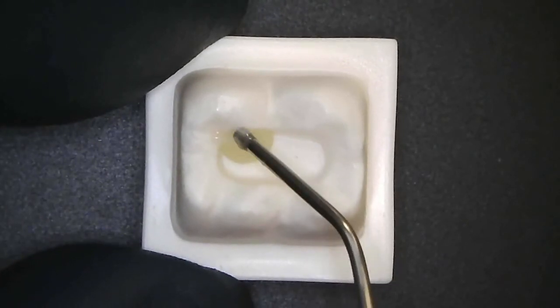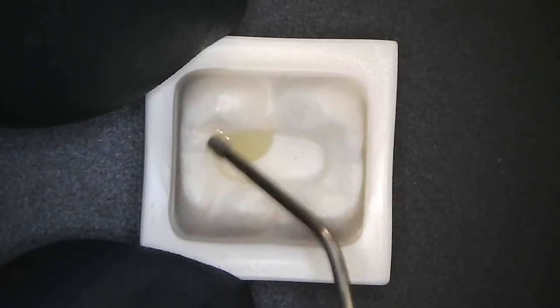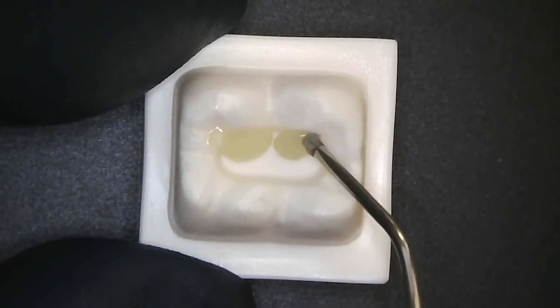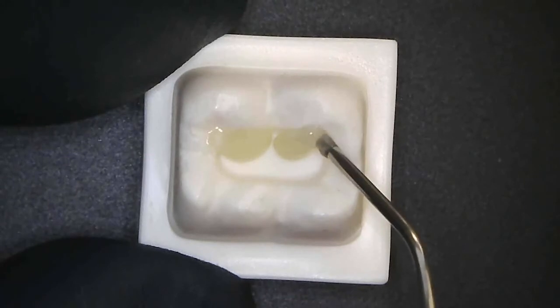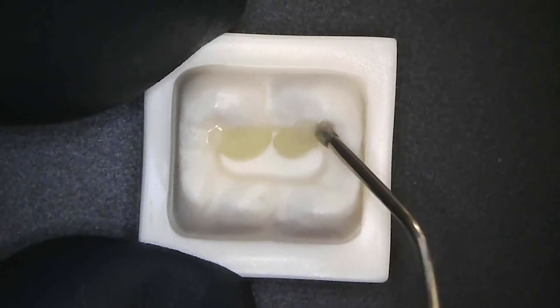Using the syringe tip, I can create a feather edge up the incline of the cusp. And here's the other cusp — you'll see it maintains its shape very nicely thanks to that tremendous stackability.